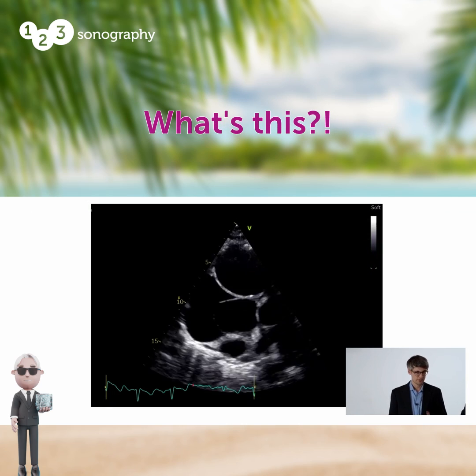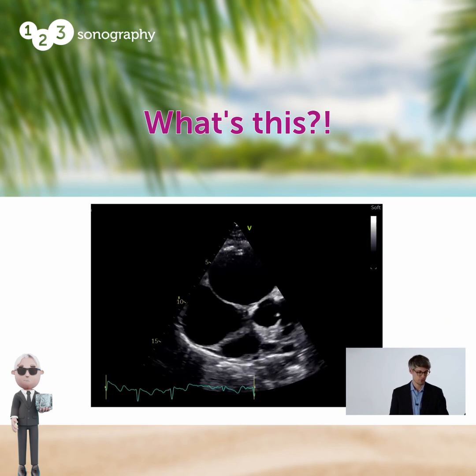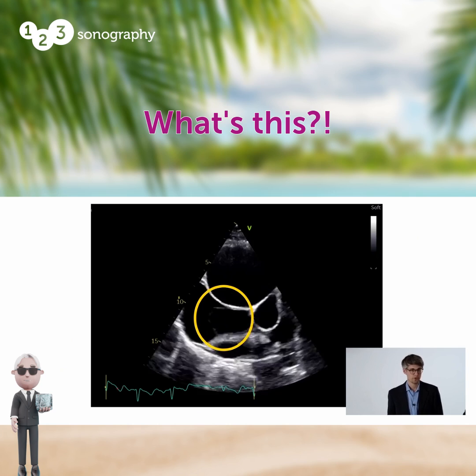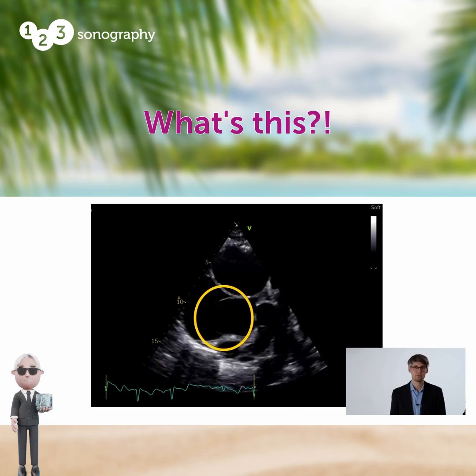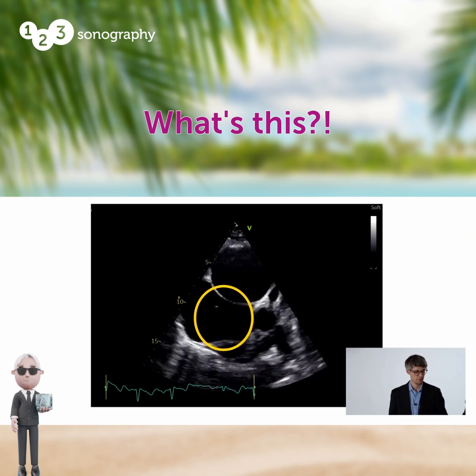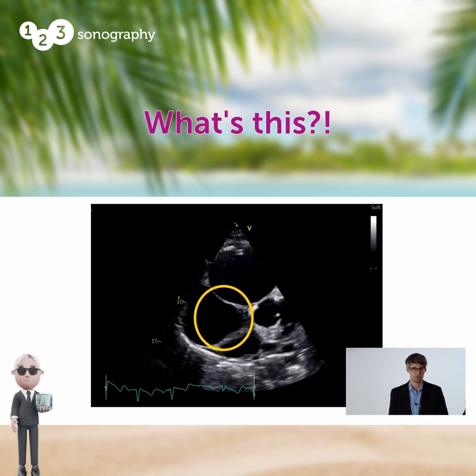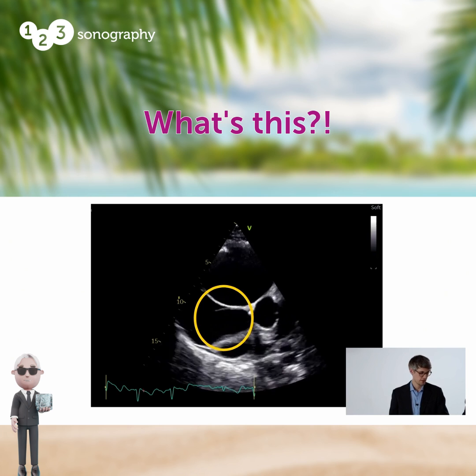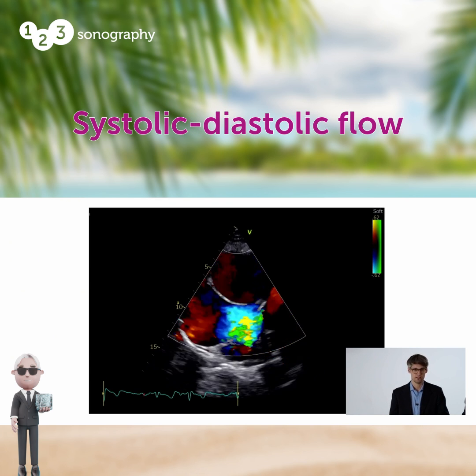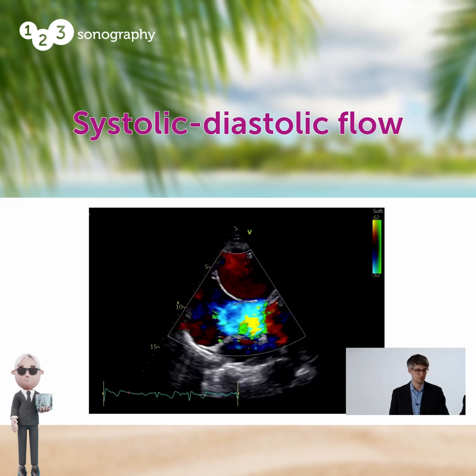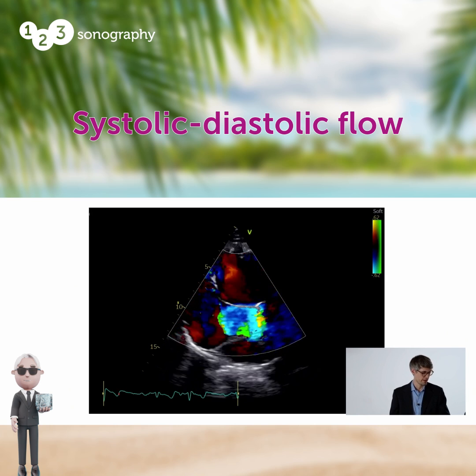There's another structure we are not really familiar with — I circled it here. There's a membrane within the right atrium. So now many really peculiar findings. When I was doing this echo, I didn't know what was going on. Putting in some color doesn't really help, because this shows really intense systolic-diastolic turbulent color Doppler flow in this separated chamber in the right atrium.